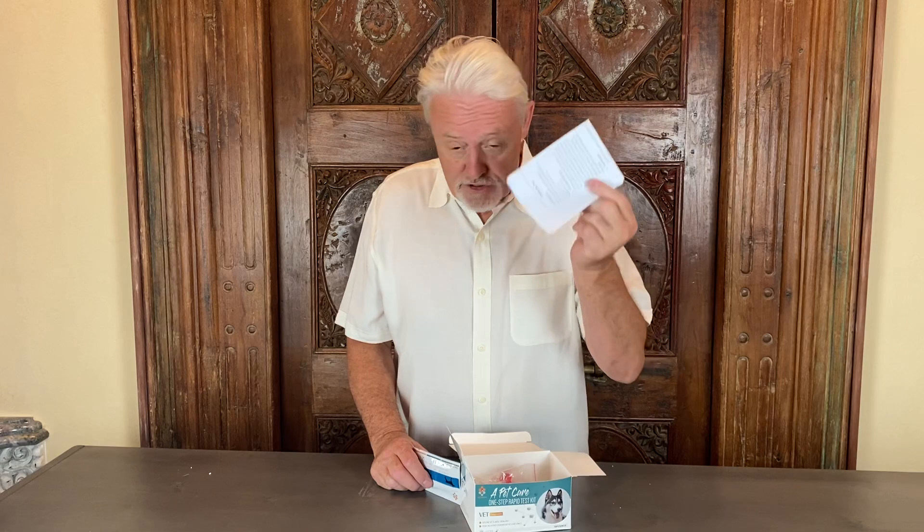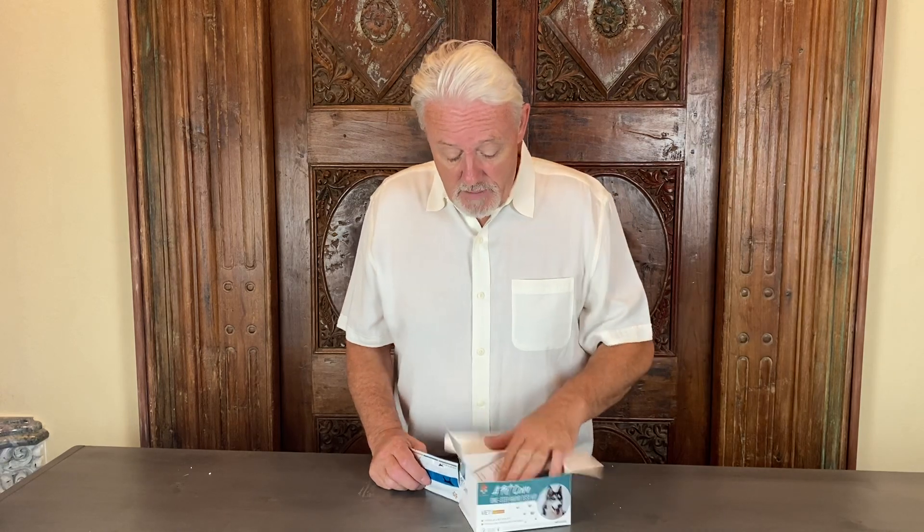If you have to draw blood, it comes with needles and syringes. The parvo test and the Giardia test don't require blood draw. The brucellosis test and the pregnancy test require that you draw blood. It's very easy to use and there are instructions included.